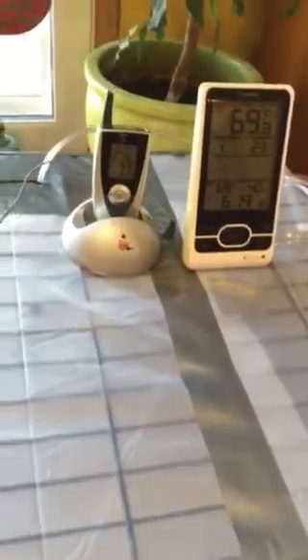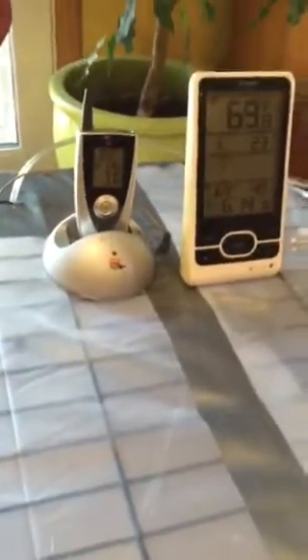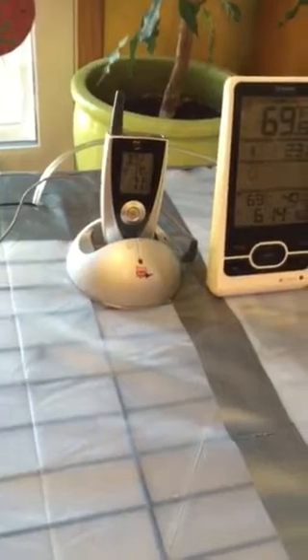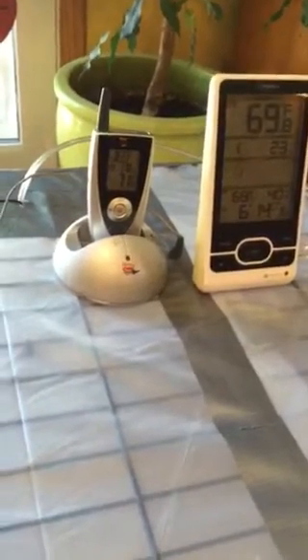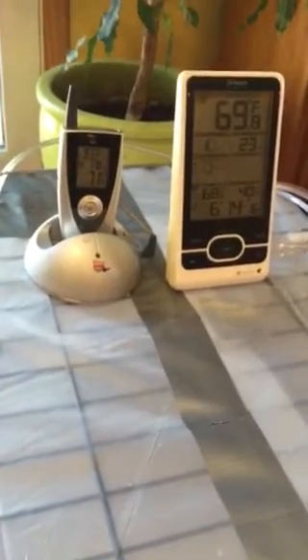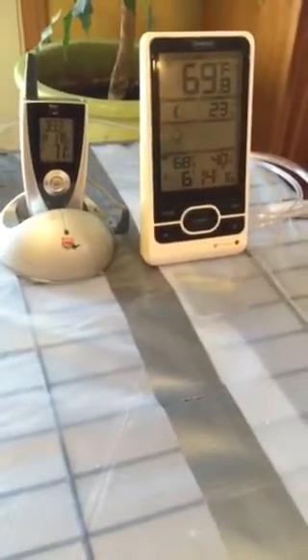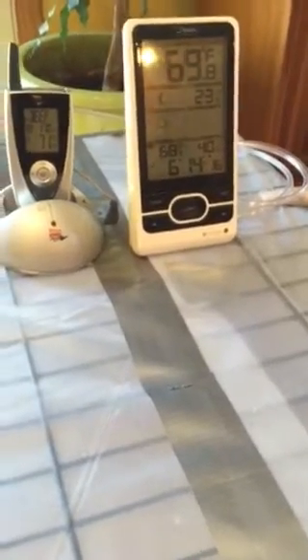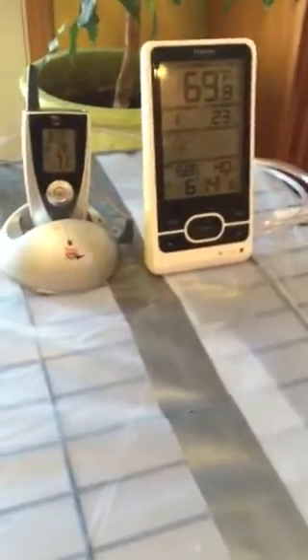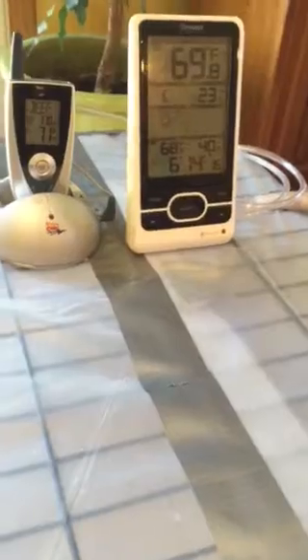Now I have 2 thermometers. One on the right is an outdoor thermometer which has a module inside, which I will show you in a minute. The left hand side is my meat thermometer, and that thermometer you stick in a roast, and it is pretty accurate. So what I did is I tie wrapped both units inside the cage, and this way I have 2 of them. As you can see, one is 71 degrees and one is 69.8. So there is a little bit of difference between the 2, but it gives me a pretty good idea. It's about 70 degrees inside the cage right now.